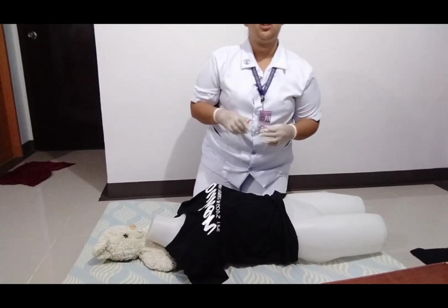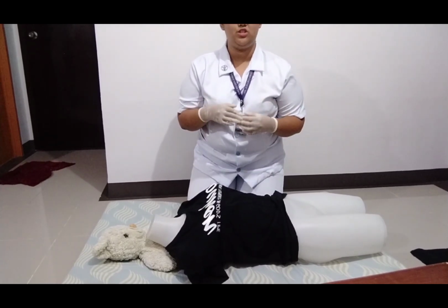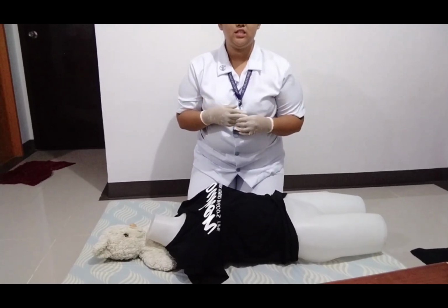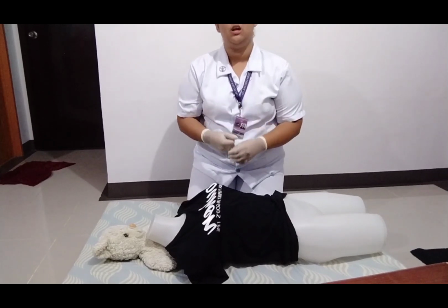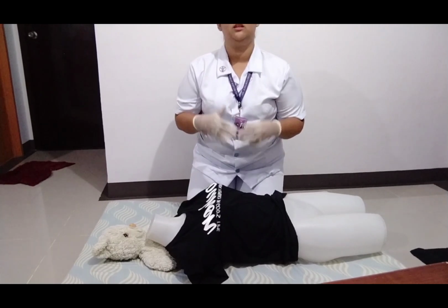So each rescue breath should be given over a second, and there should be a visible chest rise of each breath. Now, after doing that, you have to continue doing the chest compressions and then proceed to the rescue breaths again until the AED arrives, or until an emergency responder arrives to take over.